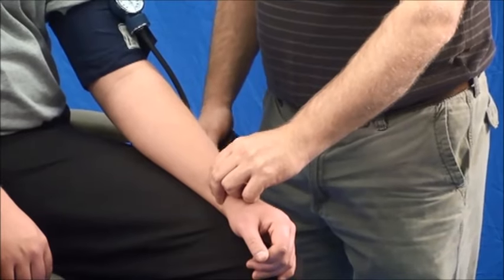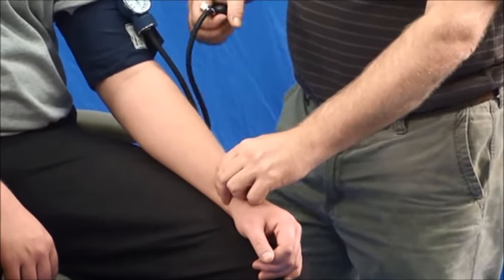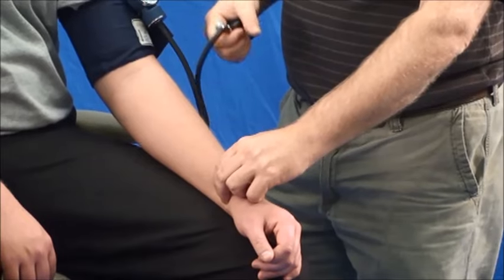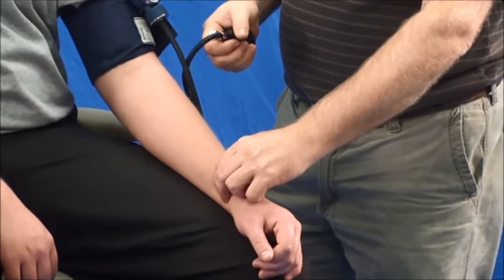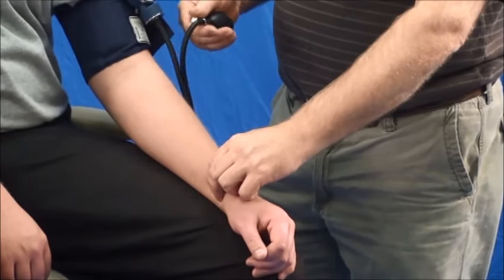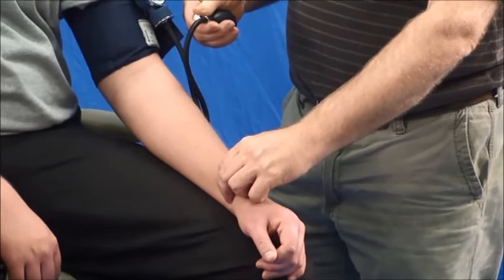Feel for a pulse again, a radial pulse. As I pump it up, I will continue to feel it and at the point where it goes away, I'll add about 20 or 30 millimeters of mercury and then slowly allow the air to release.